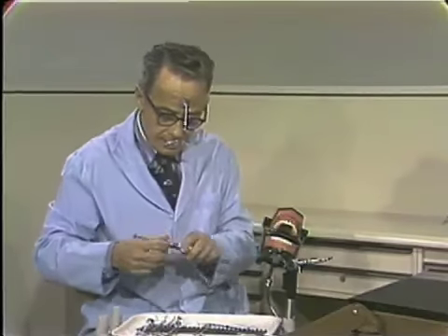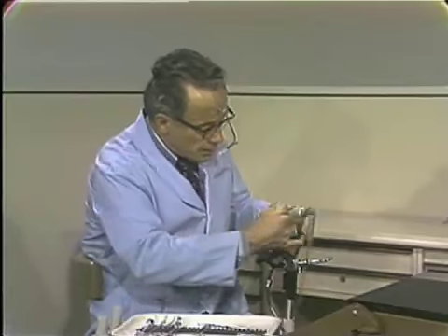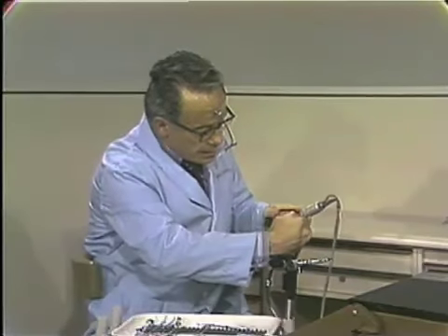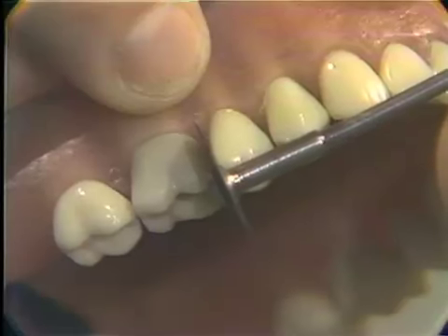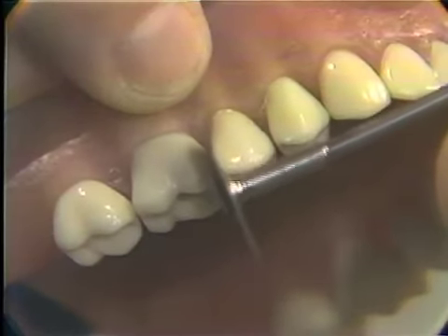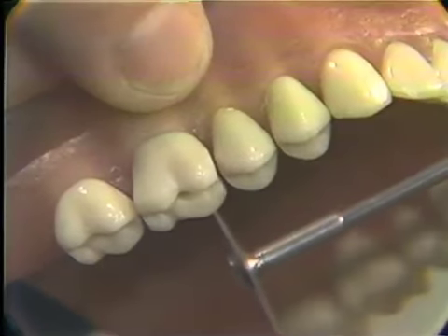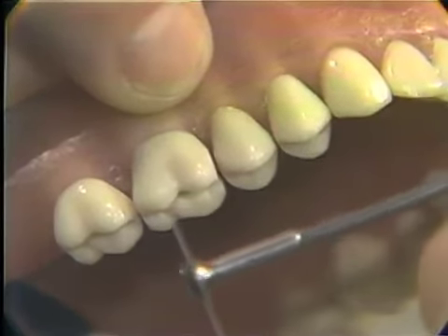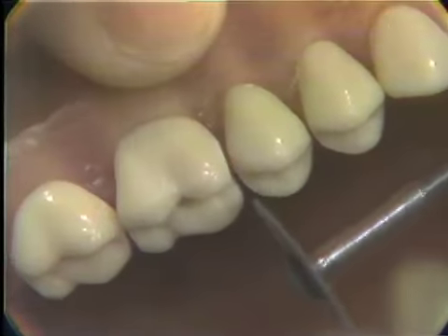As we now get ready to actually put the slice on the tooth, it shows here that we will put the disc in, and notice that the disc is not revolving. I will now start the engine and revolve the disc slowly to the occlusal portion. Now, that is probably enough for the slice on the buccal. We will go to the lingual.